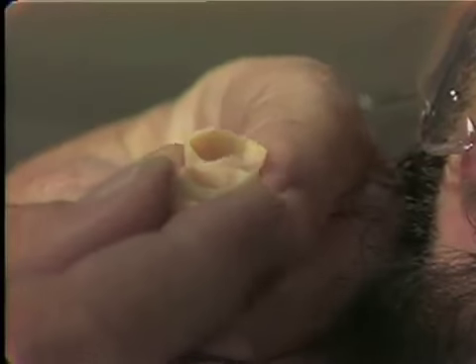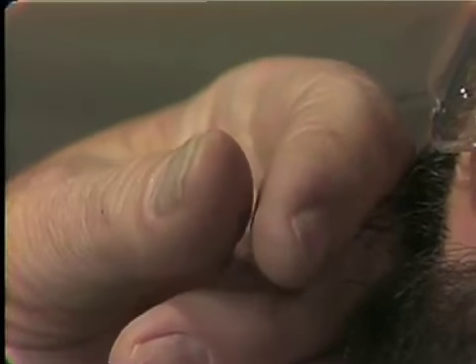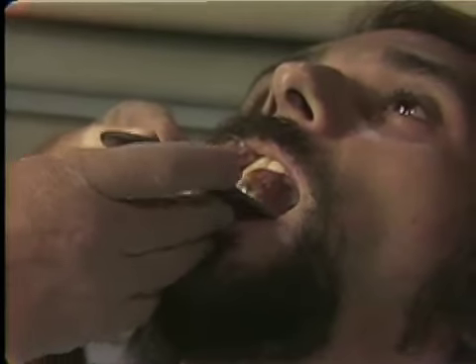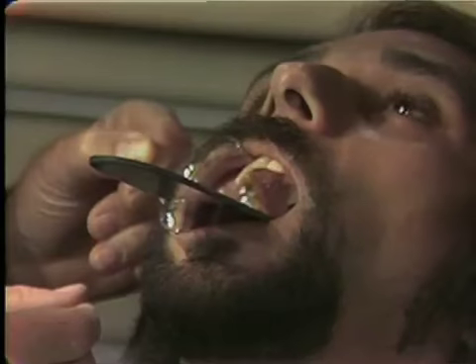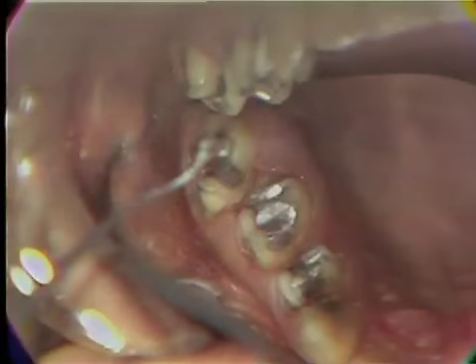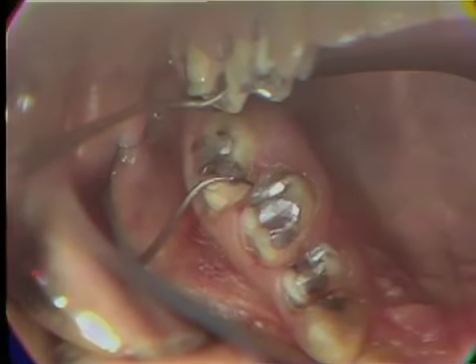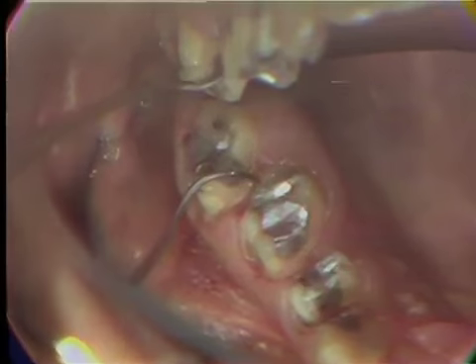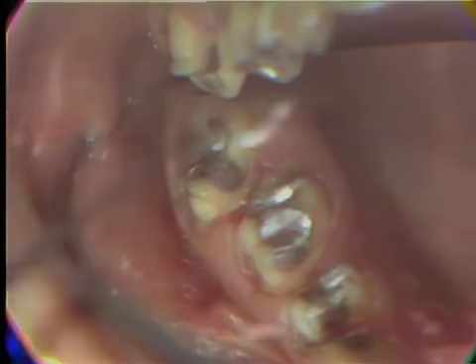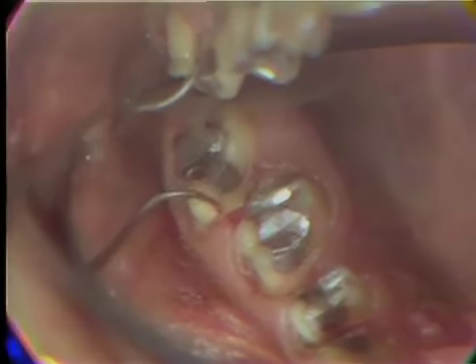This temporary has been worn by the patient for 3 or 4 days, and the tissue looks fairly good. As we would see here, the interproximal areas are fairly good. And notice on the interproximal area between the molars, these two teeth are quite close together, and we're losing a little bit of the papilla between those teeth. One of the reasons was because the acrylic extended down into the cervical areas and prevented the tissue from forming a normal papilla. So I've opened that up this time.